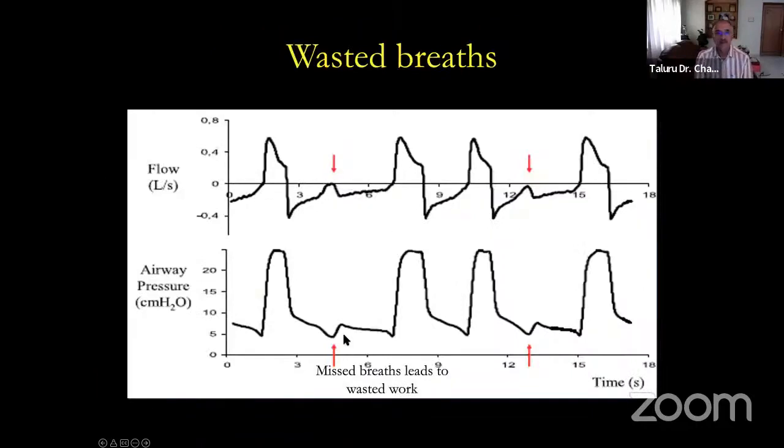See, the airway pressure has gone negative. The patient wants to trigger a breath, but there are a lot of wasted breaths. See, the patient is on pressure support. So, how would I alter this? How can you change the I:E ratio? Can somebody type here? How to reduce the wasted breaths now? See, the patient is on which mode? Say decelerating, it is happening above the baseline, so it is pressure support ventilation. So, how do you alter the IE ratio and decrease the wasted breaths here? Can somebody type?